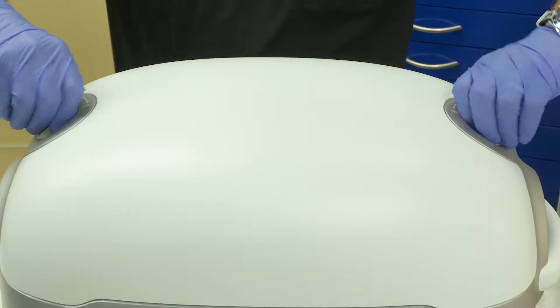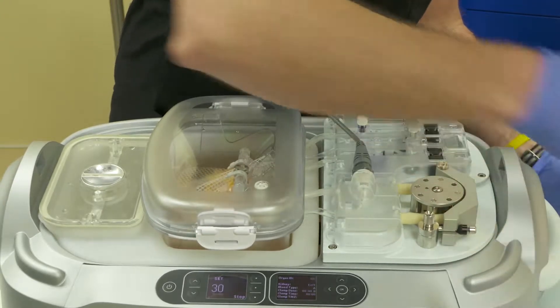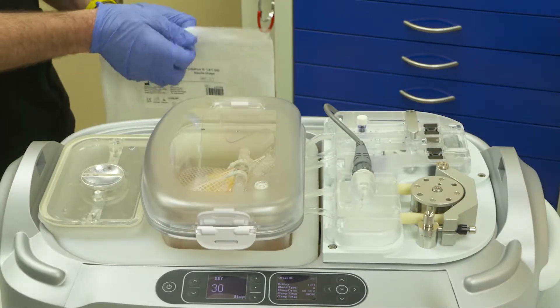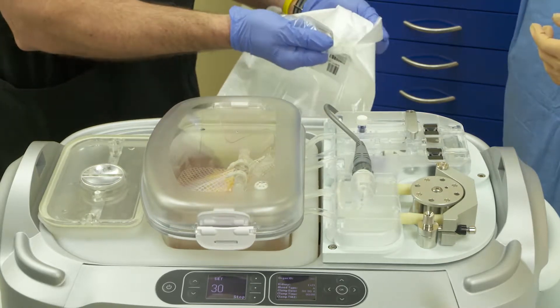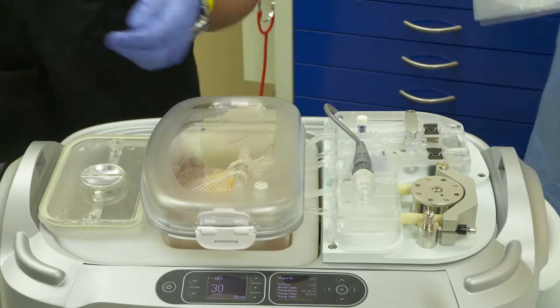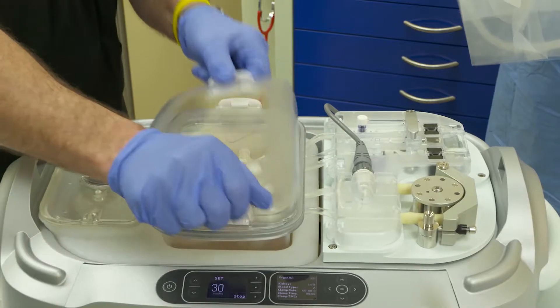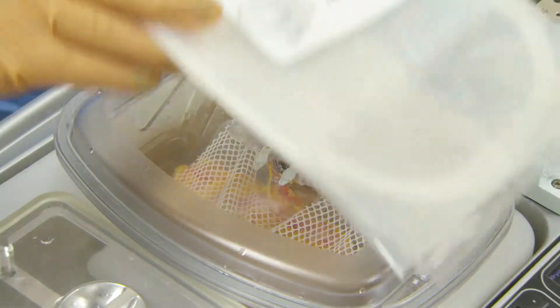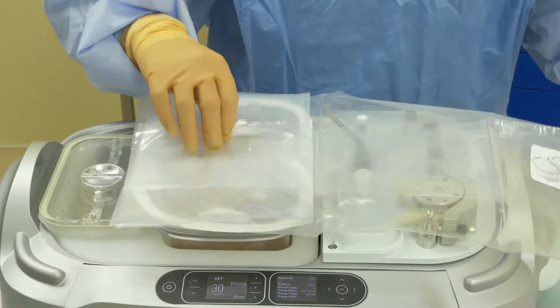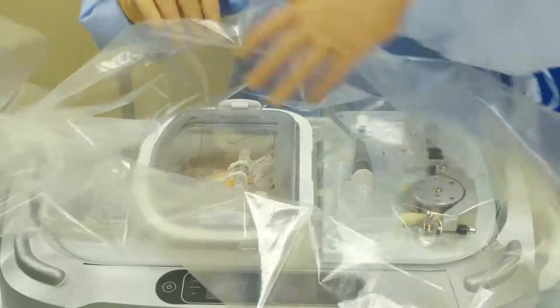When you are ready to remove the kidney from the LifePort, have someone outside the aseptic field remove the LifePort cover and open the sterile drape. Also have them remove the outer lid of the perfusion circuit. Place the folded sterile drape over the perfusion circuit and open it first along the length of the LifePort and then side to side.